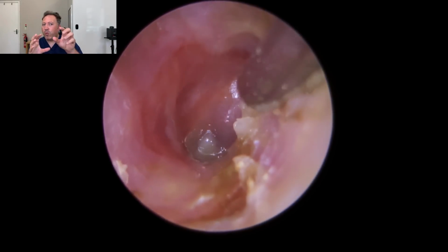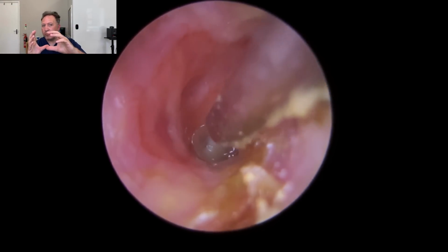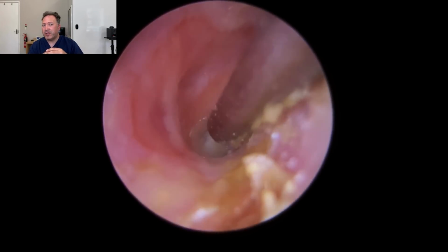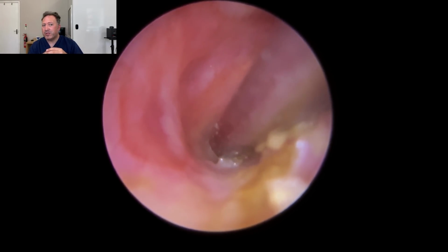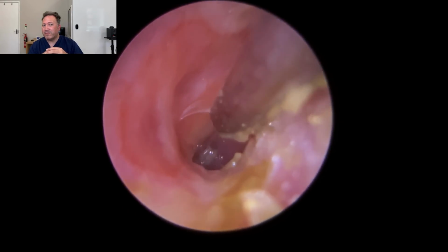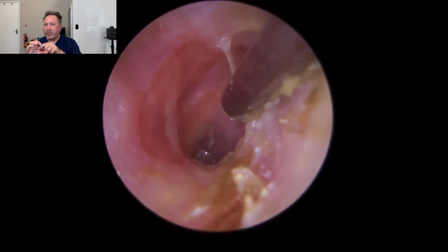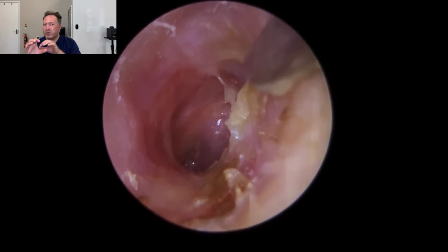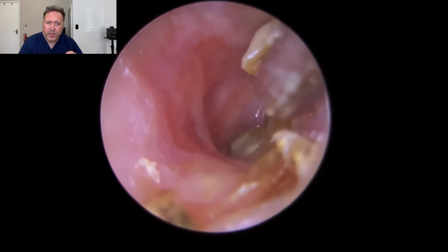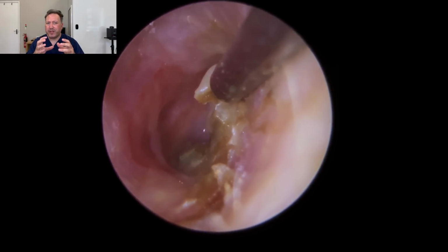And you can see that white circular section deeper into the bottom left-hand corner of the canal there. That's the bottom of the eardrum. As we suction here, we're just coming a little bit closer. Look at the liquid that gets discharged. There we are. There you go. So you can see we've got this perforation. It just looks like a recess if it wasn't as wet, but that is a perforation to the bottom of the eardrum there.